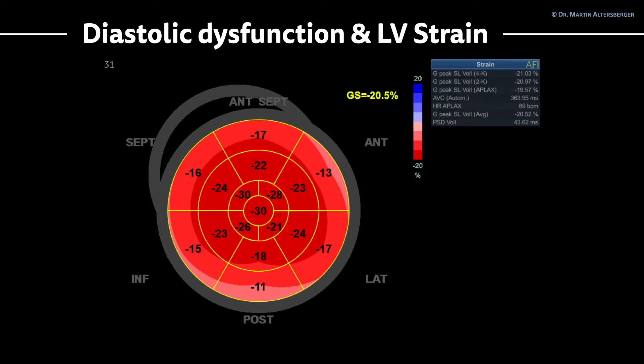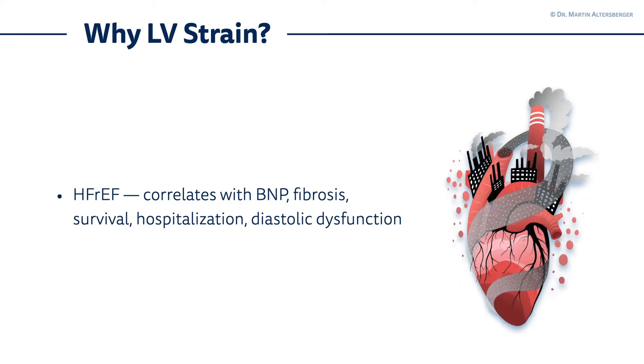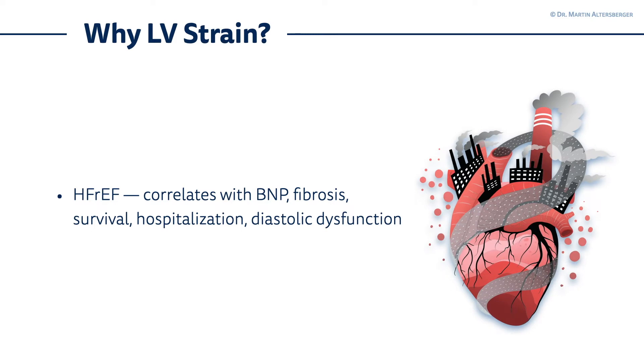The global strain, or GS, is minus 20.5%. Overall, everything below minus 18 — so minus 19, minus 20, minus 21 and so on — is normal. Minus 16 to minus 18 is borderline, and below minus 16 is definitely an abnormal global longitudinal strain of the left ventricle. But why would we measure the LV strain in diastolic dysfunction?